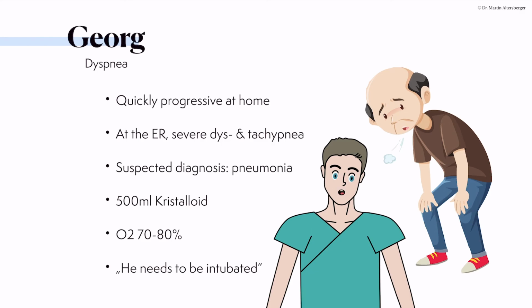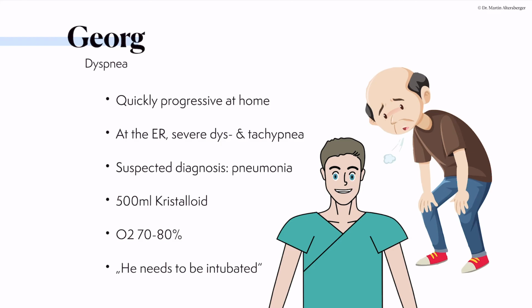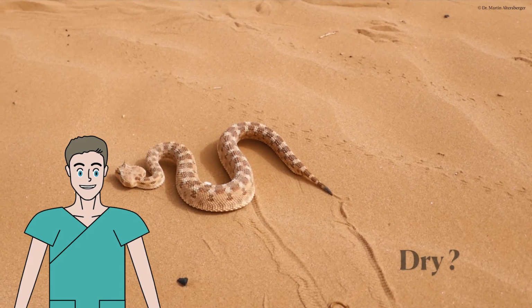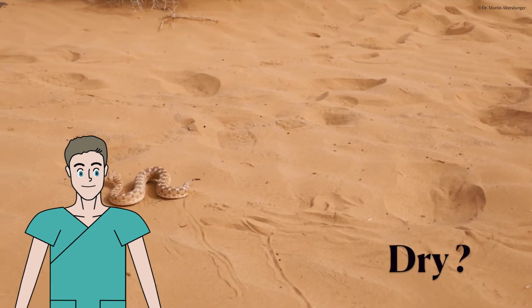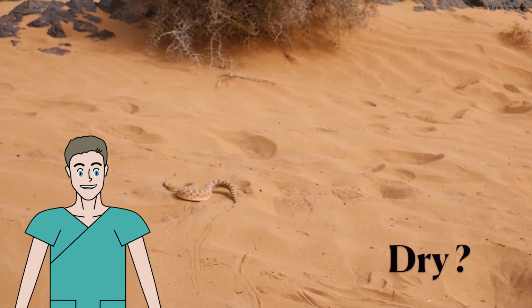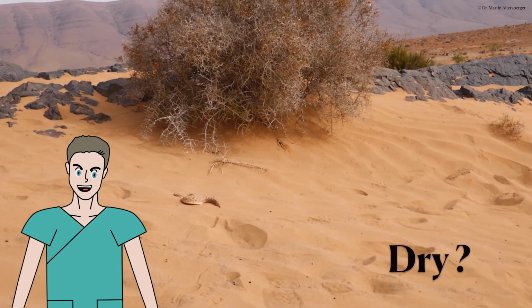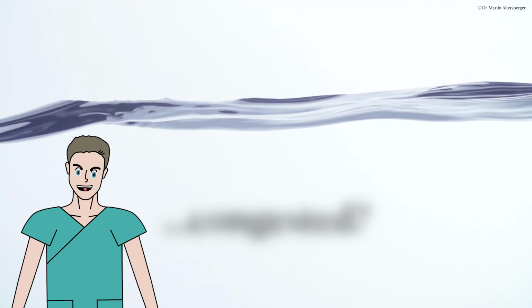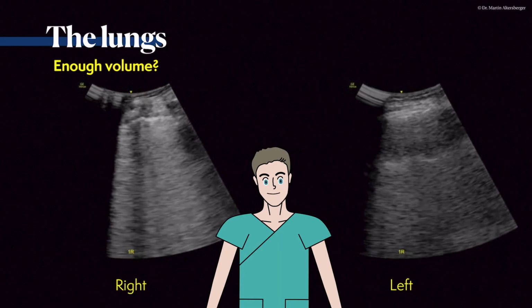His oxygen saturation, even with oxygen, is really bad, approximately 70 to 80%, and the recommendation from the emergency department is that this patient most likely needs to be intubated. Well, let's take a look and figure out, is this patient really dry, and is the dyspnea because of his pneumonia, the initial diagnosis we reported, or is he really congested? Let's take a look at the lungs.